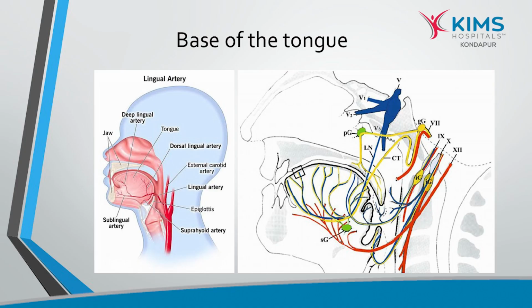So with this brief introduction of the tumor and its size, we approached it for surgery. Before going for surgery, we planned an endoscopic excision of the tumor. To make things smooth, we had an armamentarium of instruments with us. One is radiofrequency for incising the tumor and getting the plane, and we also had the Coblator within reach. These two are the main instruments we relied upon to excise the tumor.